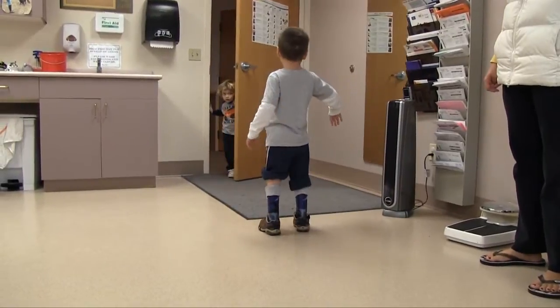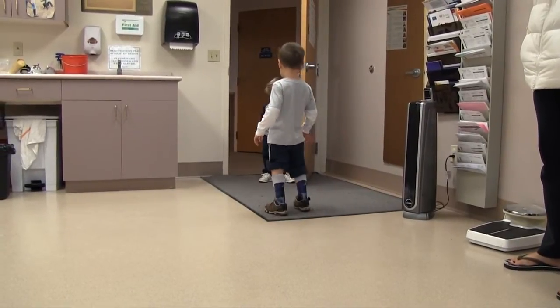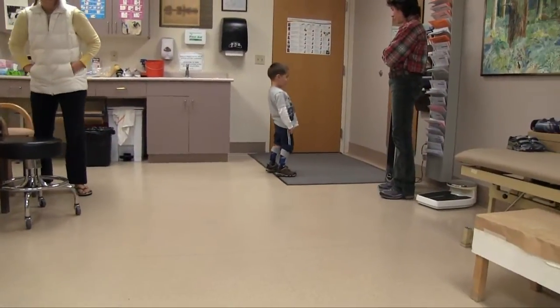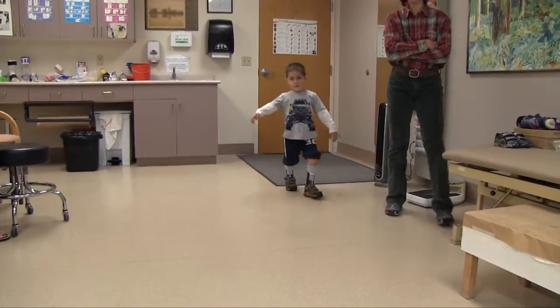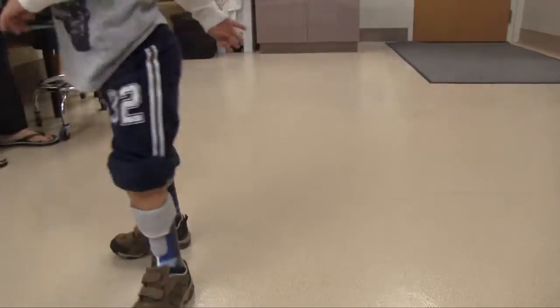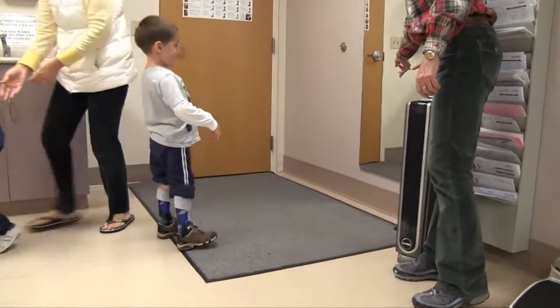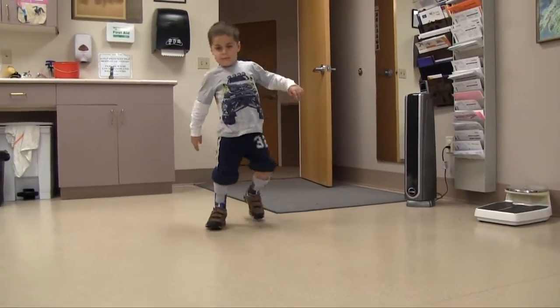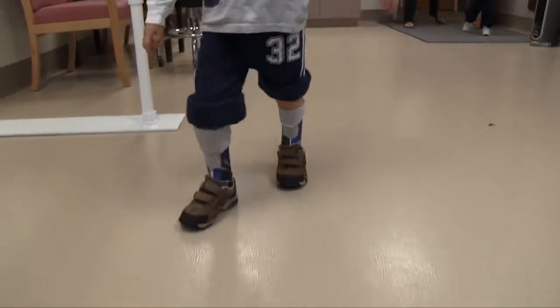When we first had Jackson stand up on the braces, his first comment was that the braces were quite wobbly. As soon as he stood up, I had some significant concerns about the dorsiflexion angle. We had set the angle at 3 degrees, and then his mom had brought in a pair of shoes — a nice pair of stride wide style shoes. However, the last of the shoes increased the dorsiflexion to probably about 7 degrees, which is creating a semi-flexed knee position for him. He's not comfortable in this position. His previous braces had been set at 90 degrees, and this was actually just a mistake on my part when filling out the order form.